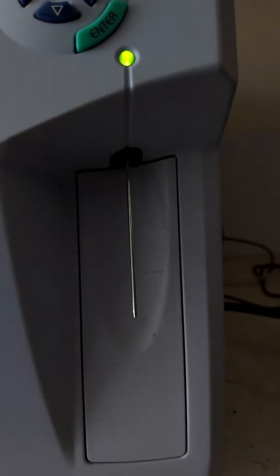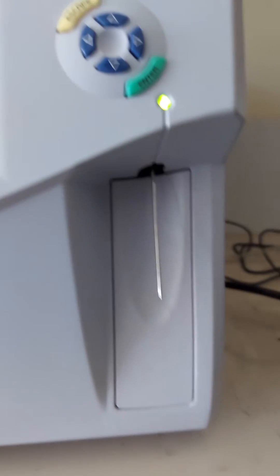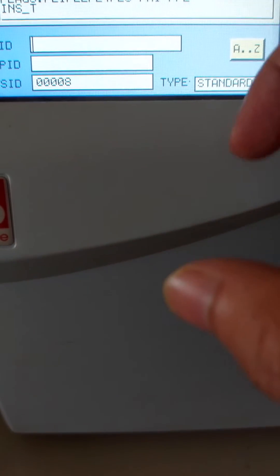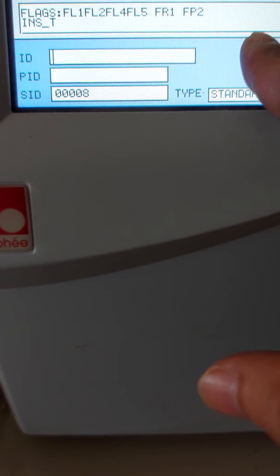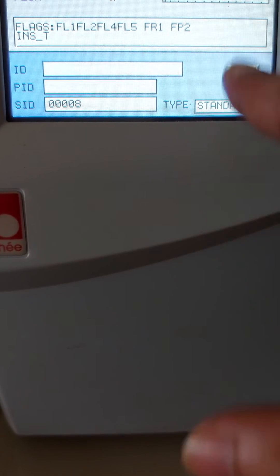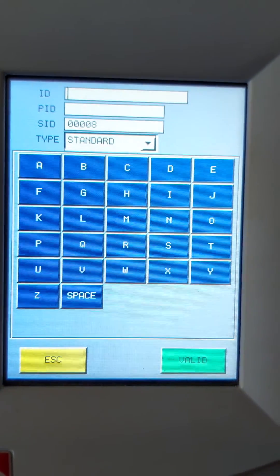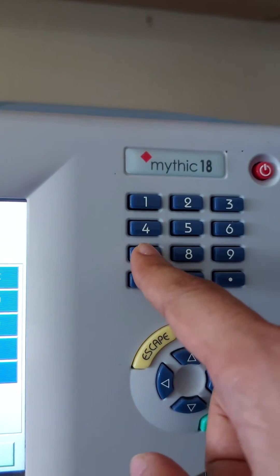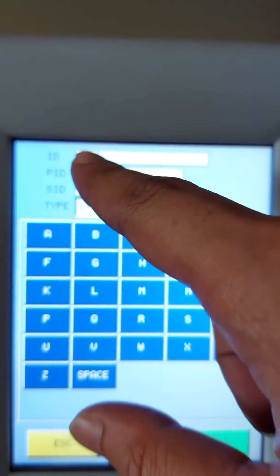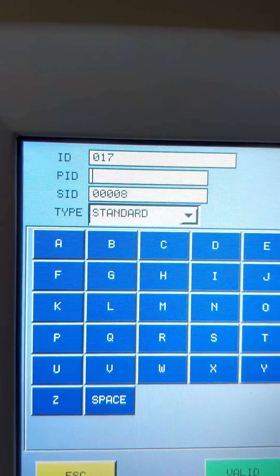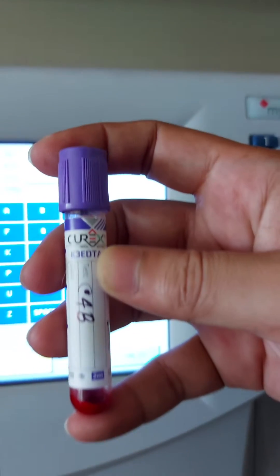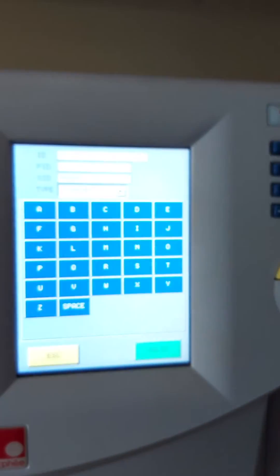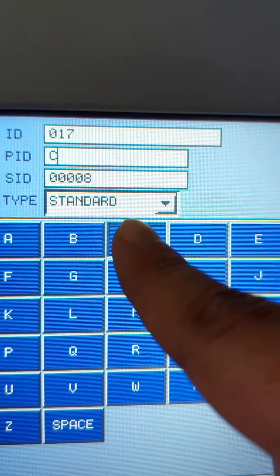A probe will appear from the analyzer. Then we will put the ID number and PID number. For example, our ID number was 017.